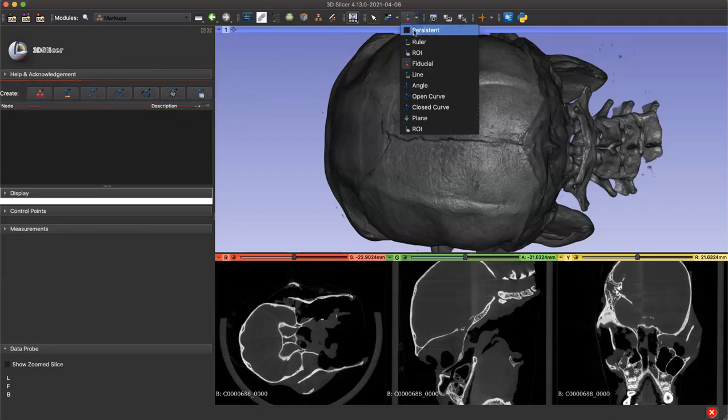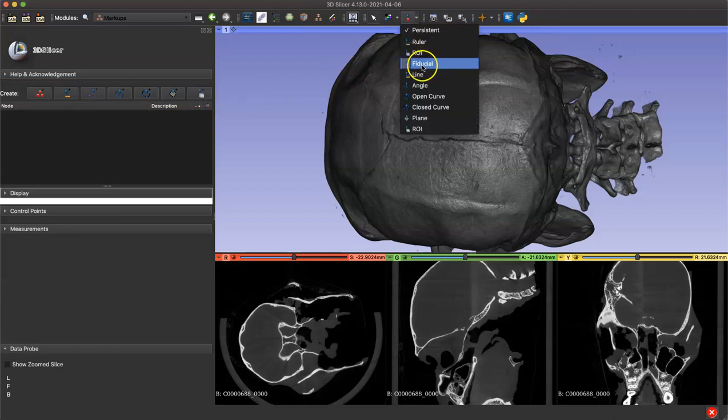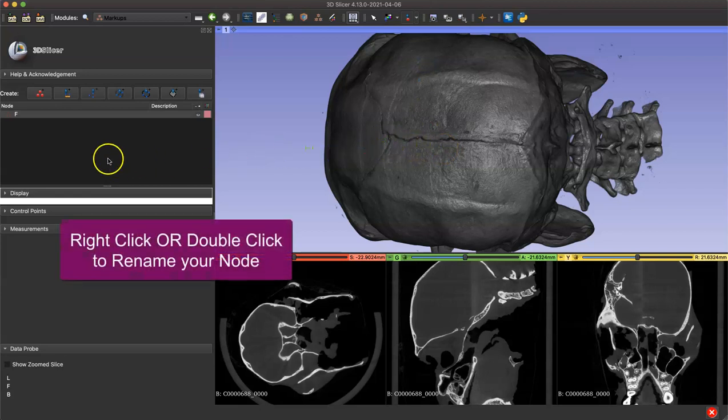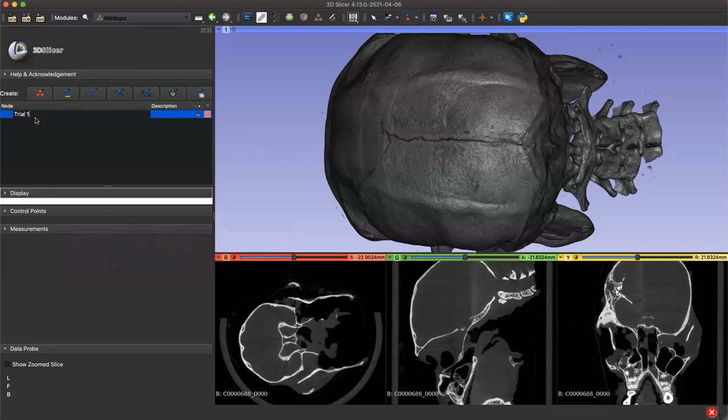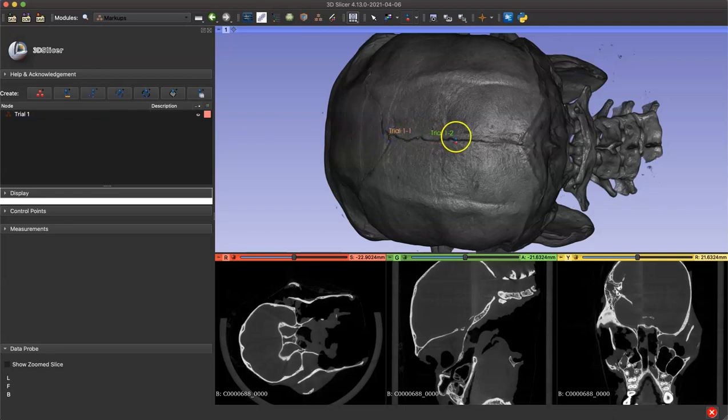There are two ways of placing fiducial points: using this shortcut or these buttons on the left side menu. By selecting persistent and then fiducial, you can continuously place points with every click of your mouse. Before I place my first point, I'm going to right click or double click on this node that I've created and rename it as trial one of my study. Now you can see the text accompanying my point says trial one dash one, meaning it's my first landmark.